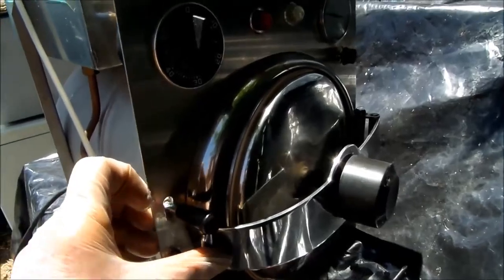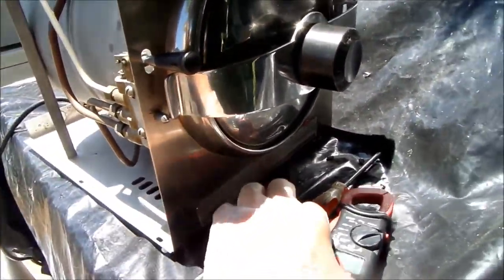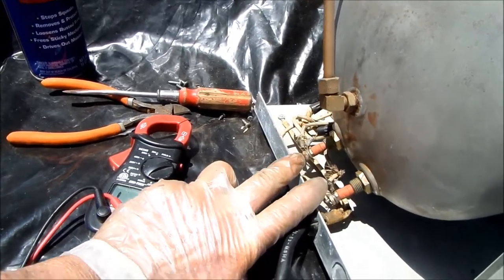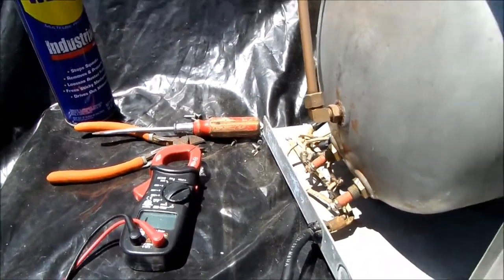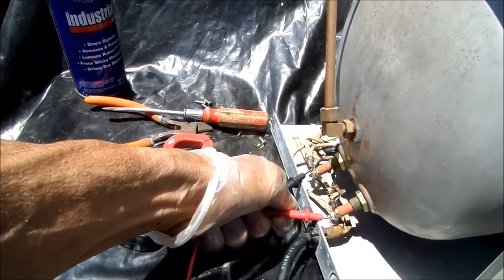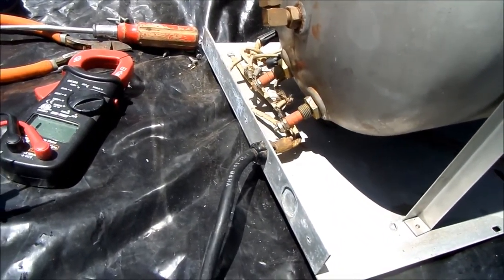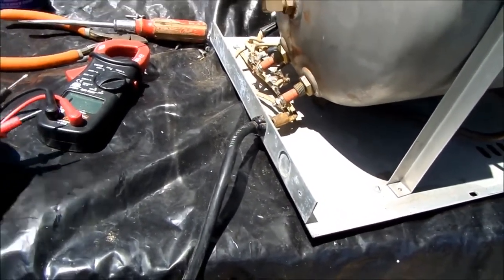Here's your American sterilizer. What we want to do is check the heat element. This is your heat element right here. Set your meter on continuity and run your probes across these two terminals. We can see that this heat element is still good.